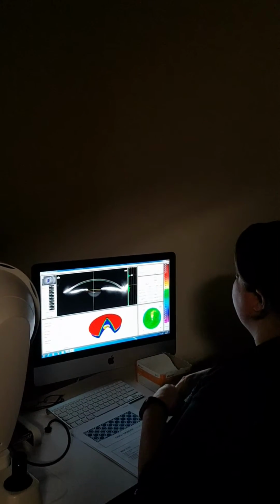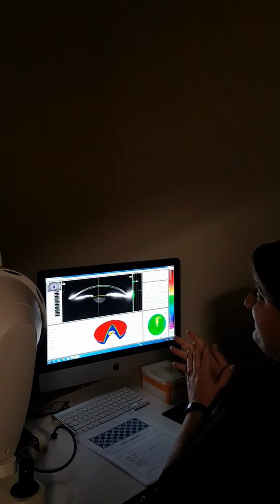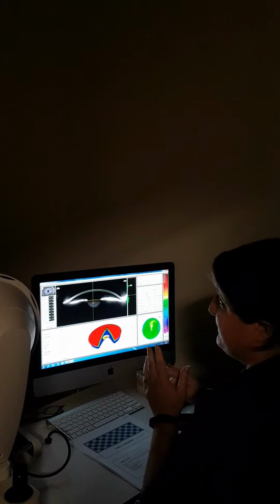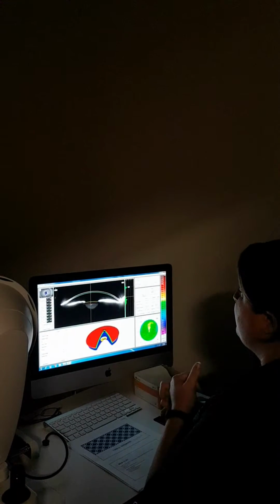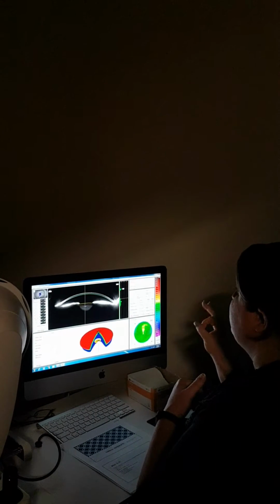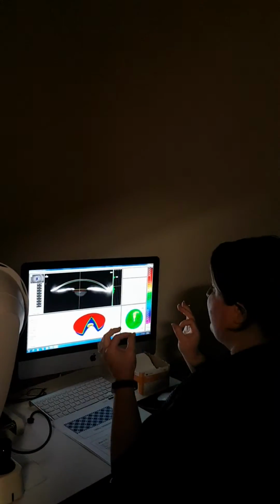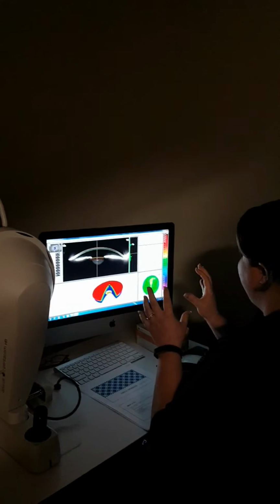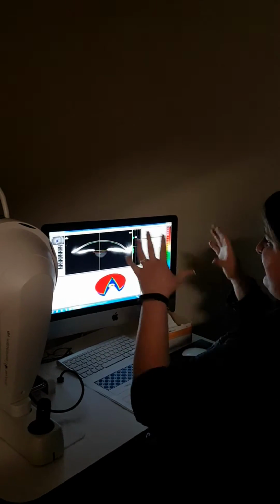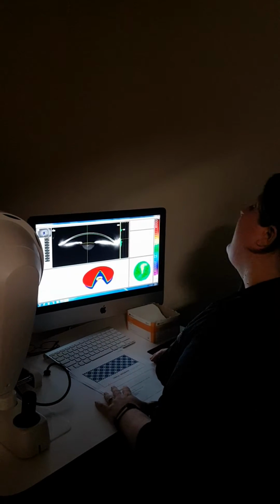Okay, and again, if the patient's, yeah. I've had it say model. Uh-huh. What does that mean? I think it's having a hard time. I'm not 100% on this, but from my understanding is that it's not able to run the normal values is what I understand. Does that mean my scan's good? Do I retake it? I would retake it.